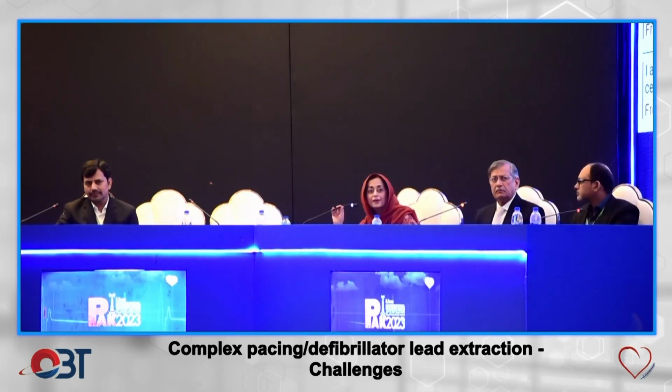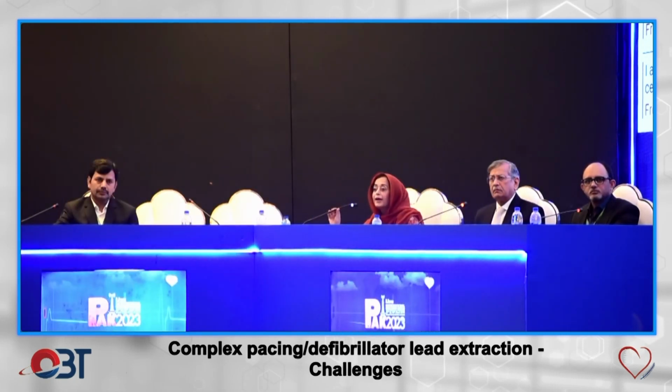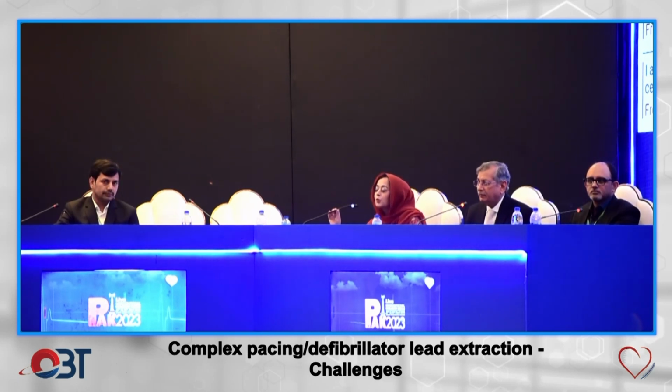Doctor, I just want to make a comment, Dr. Amer. It's really a wonderful case, and you presented it in a very nice way. As it is a fellow corner, I just want to highlight one thing. First, it was placed in 2014, and secondly in 2022. What happened that it got infected? Because most of the time we are not following our checklist for infection control. So the take-home message is we must do that checklist properly so that we prevent all these complications later on. Thank you, Chair.